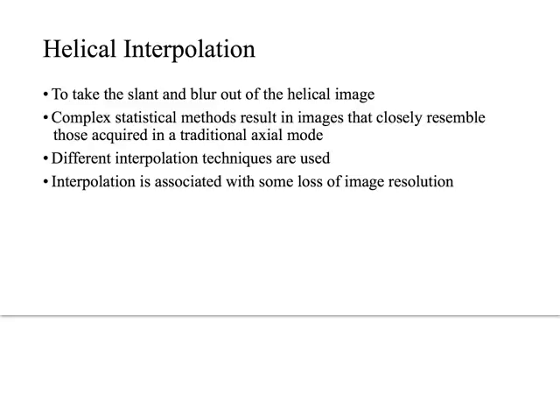This is basically a degradation in slice sensitivity. We no longer have slices that are as sensitive to the area that we're scanning as we want them to be. She says that at the top of the page on the second column. Slice blooming is a degradation of image quality. It degrades image quality. So we are going to use these different interpolation techniques to try to mathematically correct that, right? And so she says interpolation is associated with some loss of image resolution. That is true, and slice blooming is the way that that occurs. Let's talk about what that actually looks like.